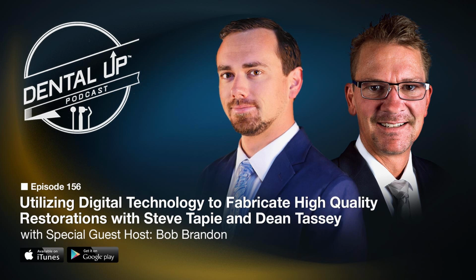Well, we're beginning to enter kind of the second generation of intraoral scanners. Things like full color scanning are coming out standard. Itero, Trios, the Medit i500, Carestream, they're all color scanners now, which only a couple years ago was more of a luxury than anything else. Right, and a significant cost upgrade. Of course. That can really help with margination. The color contrast between tissue and dentin or enamel is very helpful. Pretty evident, yeah. Absolutely.